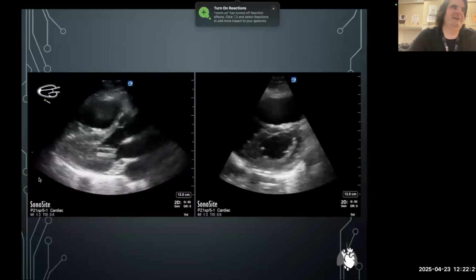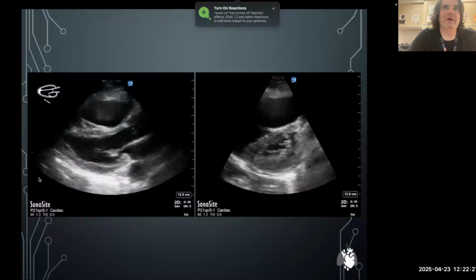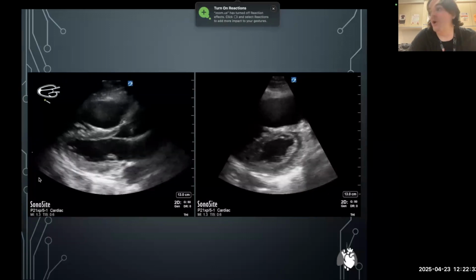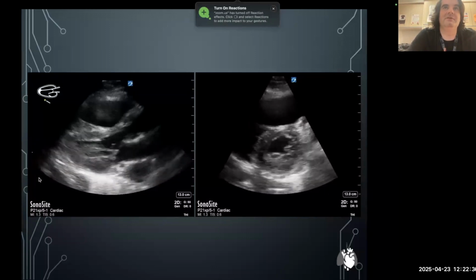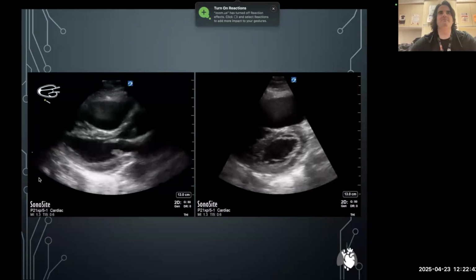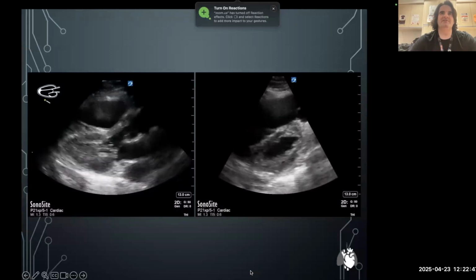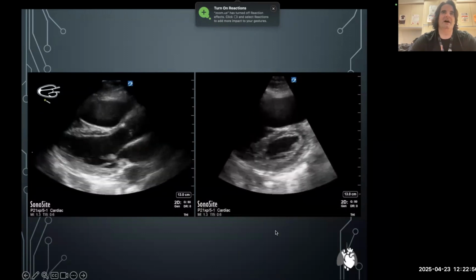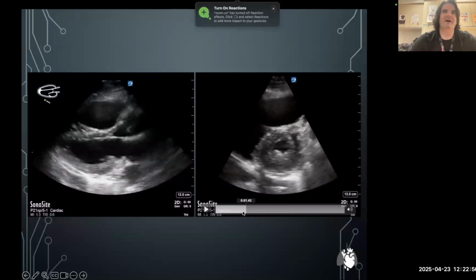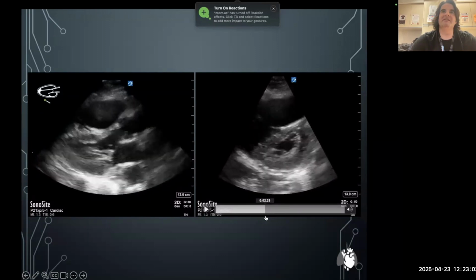It's pretty quick, right? It's pretty tachycardic, so it's kind of hard to say. Pardon me? Hyperdynamic LV. Okay. Pardon me? The RV's dilated. Yeah, RV looks big. Yeah, it's really hard to say, just with the rate, to be honest, when there's no cine function and ECG, whether this is persistent, but I'd be concerned that this is persistent flattening. It's maybe a bit more flat during, I think it's more during systole, to be honest, like mid to late systole, right?